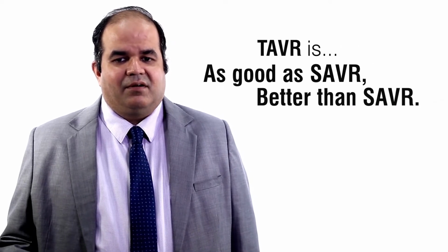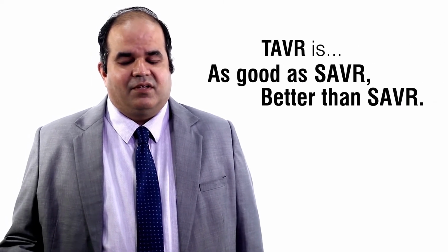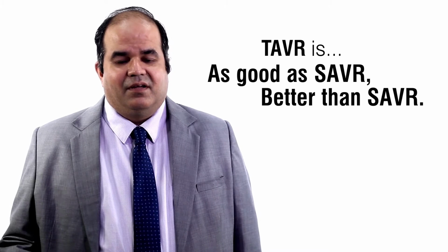There are trials comparing surgical aortic valve replacement with TAVR, and it has been clearly shown that across all risks, low, intermediate and high, TAVR does as well as SAVR, and in many cases better than SAVR, in degenerative tricuspid aortic valve stenosis. At the same time, TAVR is also better than SAVR, a redo surgery, for patients with previously implanted bioprosthetic surgical valves at the aortic position.